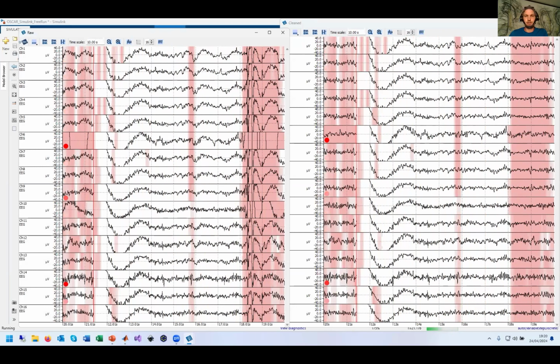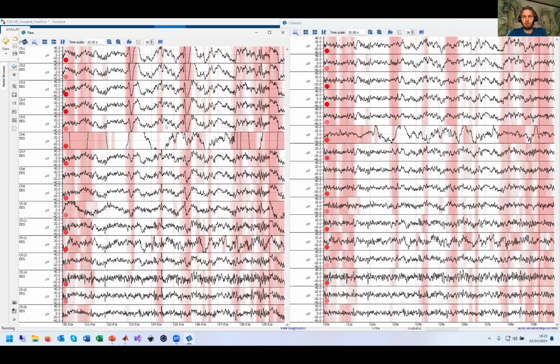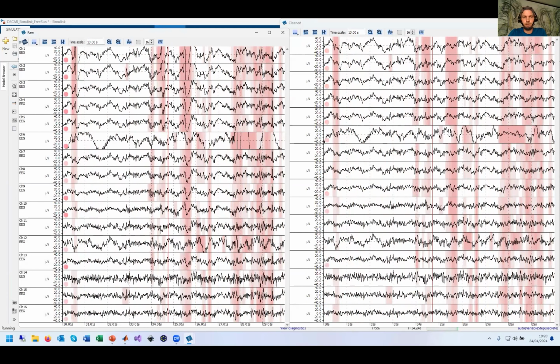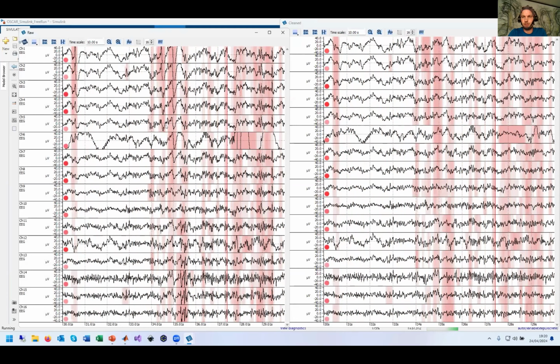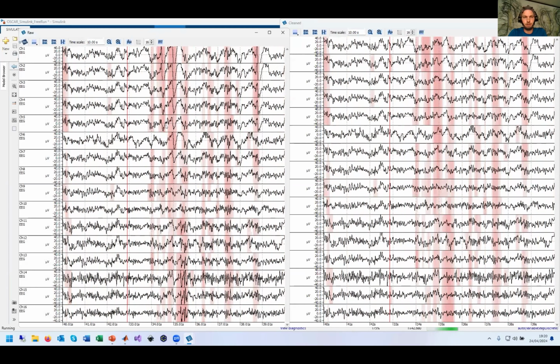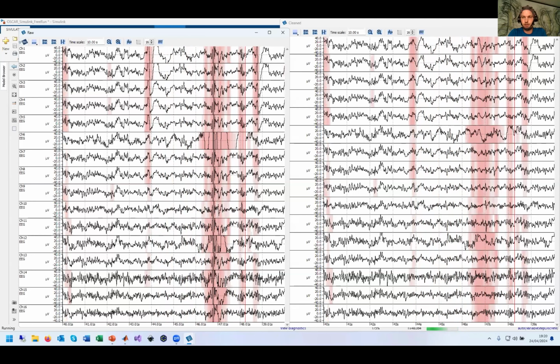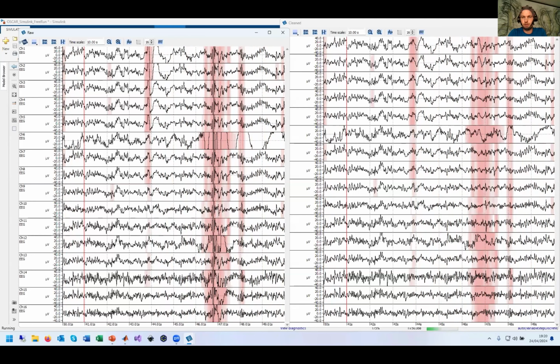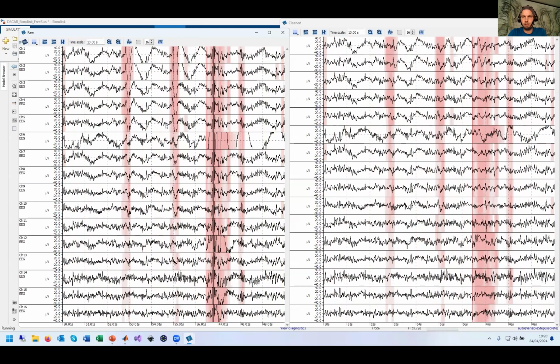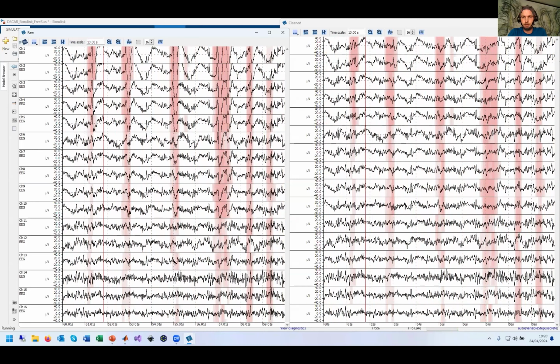So you can see on the left side, you can see the raw signals that are recorded right now. Looks good. On the right side, you can see the Oscar signals. So those are the signals corrected in real time. We have 16 channels. You might have noticed that channel 6 is a bit bad. That's okay. It's floating around. Yeah, you have also seen maybe that I have already introduced some blinks to the data. They're all nicely corrected.